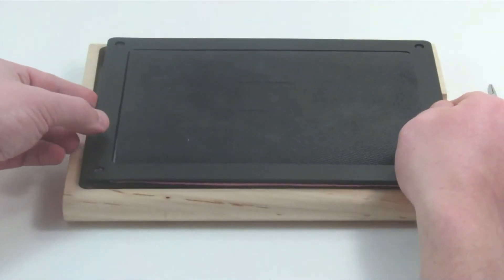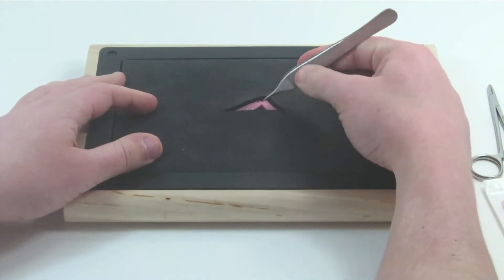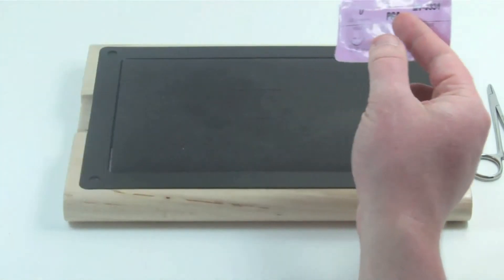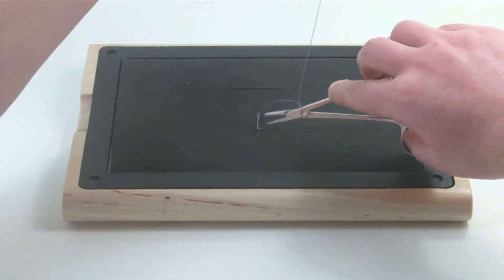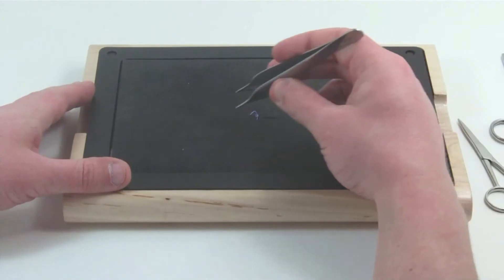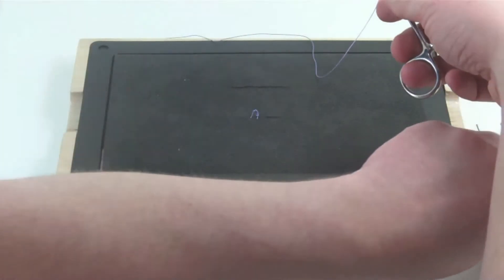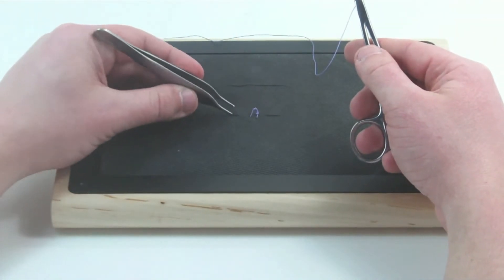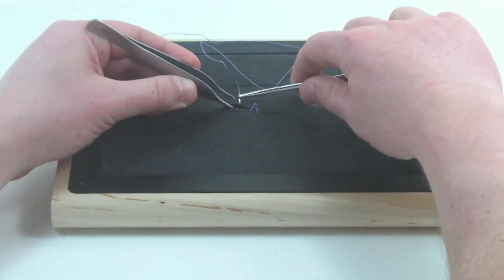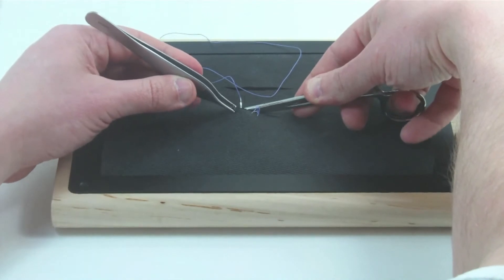Many different lacerations can be made onto the suture pad. You can even practice subcuticular closures. The suture pad is made up of a quarter inch subcutaneous layer and a one-eighth inch dermal layer, and was designed to replicate the properties of human skin. This includes elasticity for creating elliptical incisions and gut approximation of wound edges.